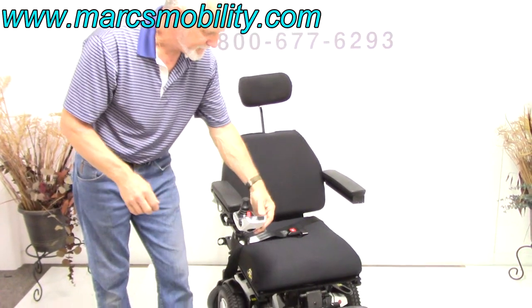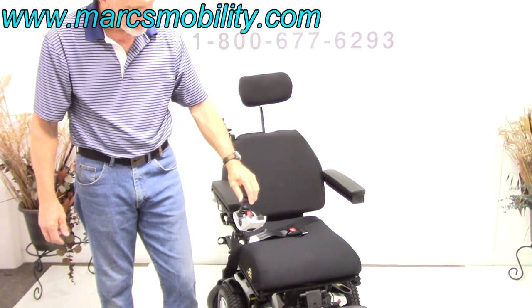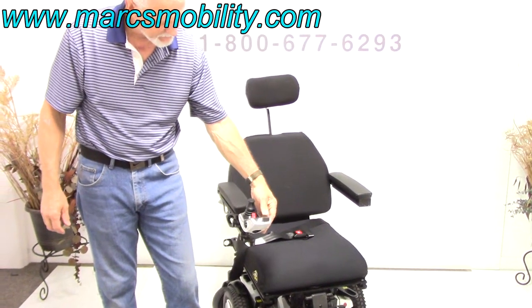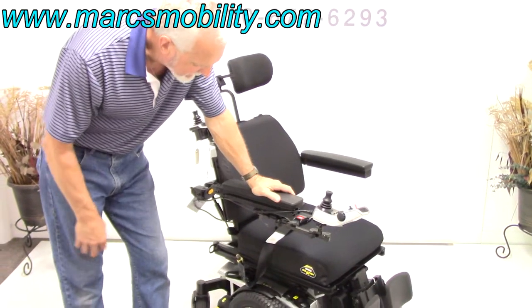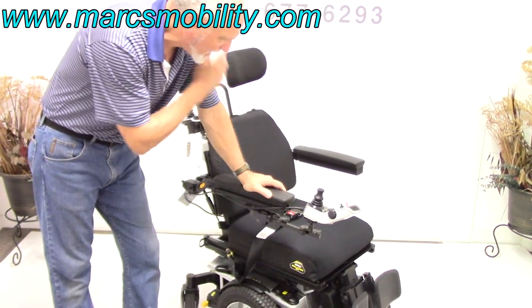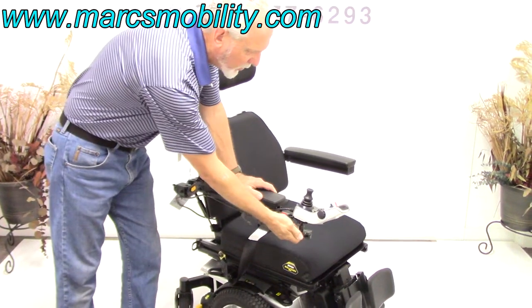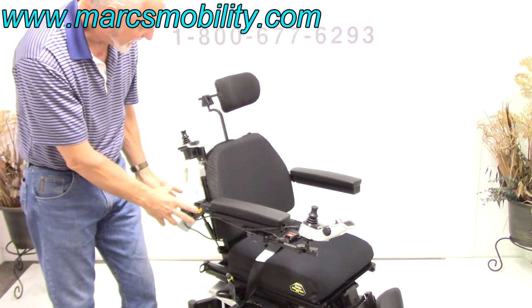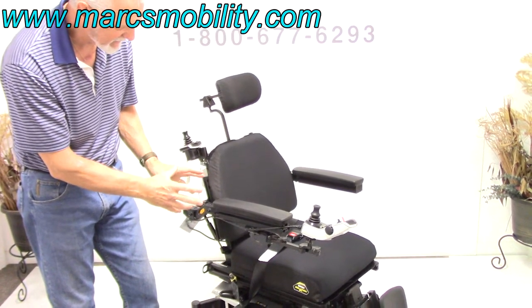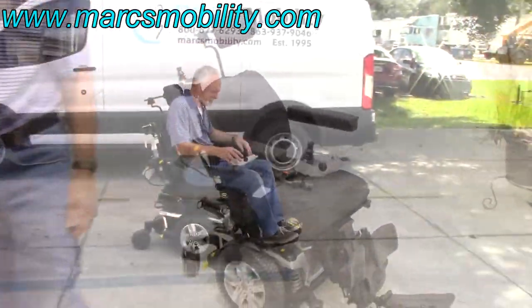If you're looking for a power chair in new condition with tilt, recline, and legs, a safety belt, Synergy Solution cushion, swing-away joystick, and attendant control — with just 35 miles and a sharp metallic silver color — this is a nice one and it's ready to go.